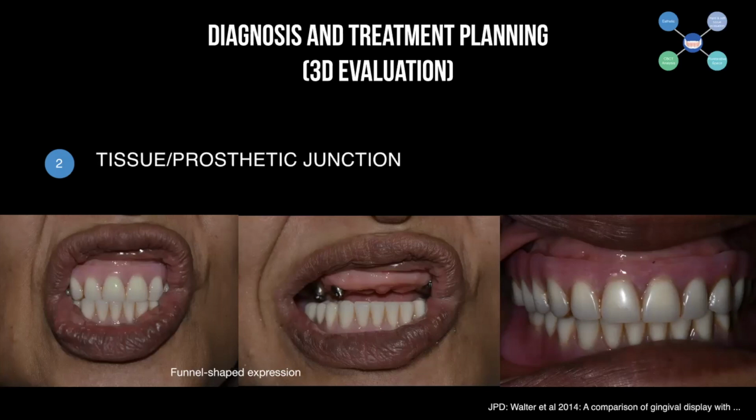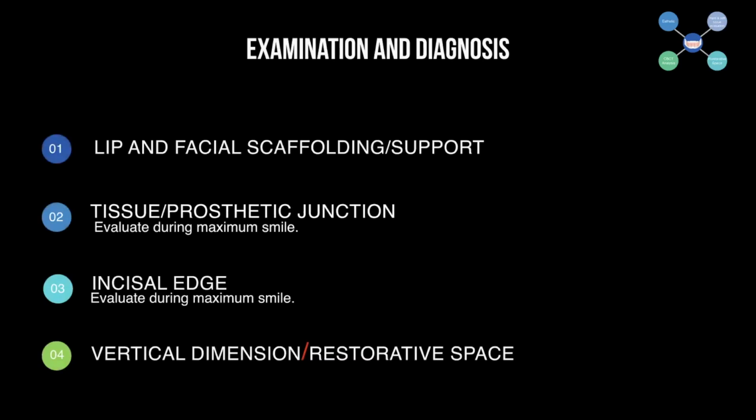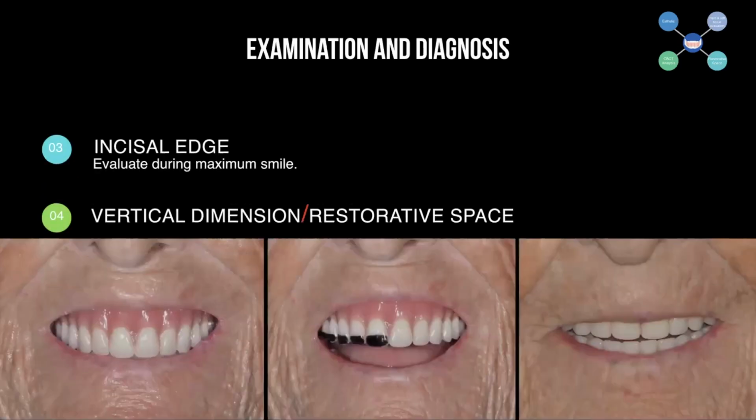And definitely, I'll show some slides at the end, and you will see even for hygiene purposes, it's a terrible prosthesis. The patient cannot clean it, so they have to come more often to our department to get it cleaned. And the lower edge is removable. But you will see the incisal edge, on the other hand.